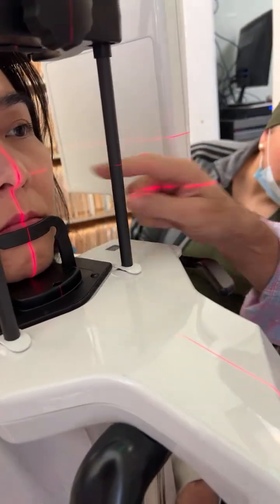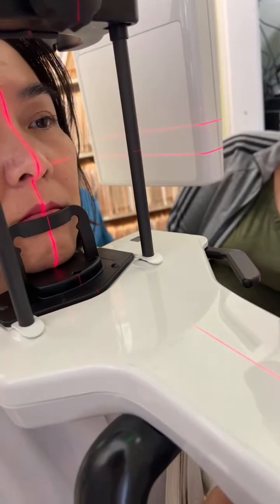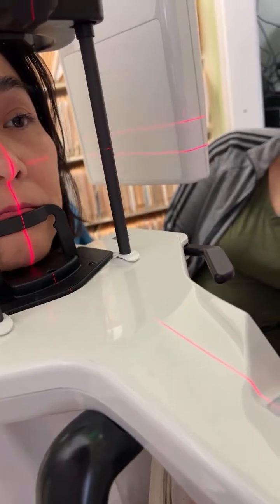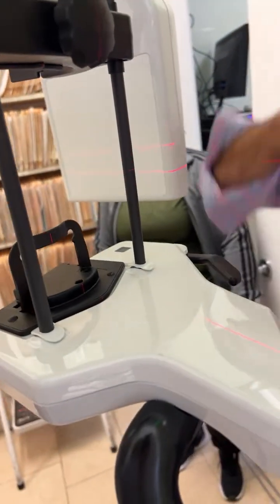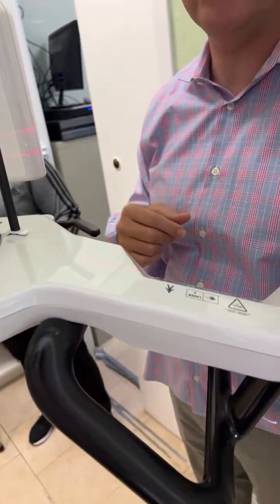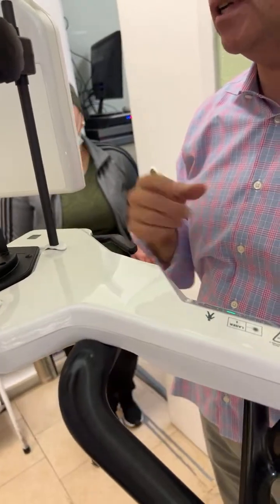So now look how much height we have. You're very high up. Is that the maximum height we can do, or the light? I'm saying, is that the maximum horizontal? I don't know what it's set for. Is it 9 by 11? So that's 5 by 5. So if you wanted more height, you could switch it to 6. You could switch it to 9. You could switch it in between those.